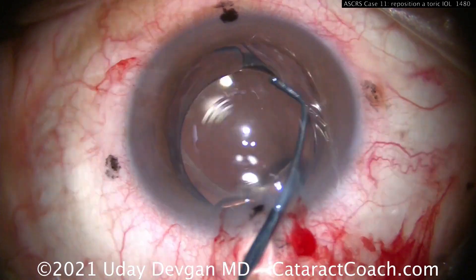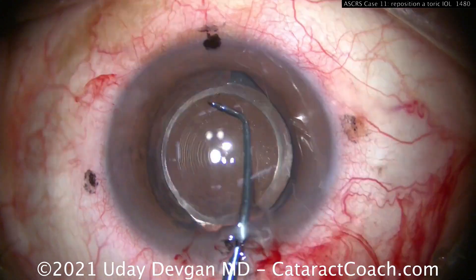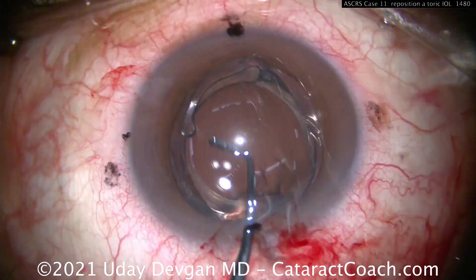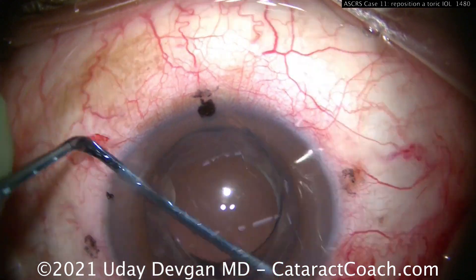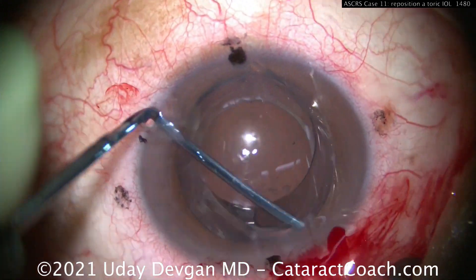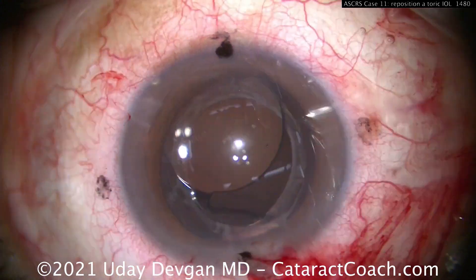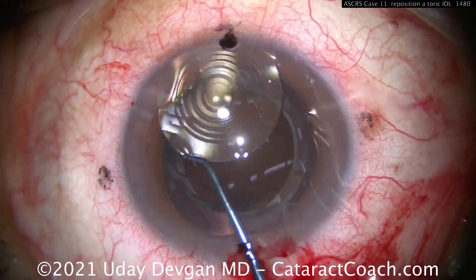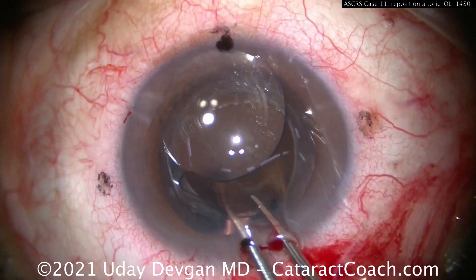There's visco-dissection going behind the optic — dispersive viscoelastic to help separate it. We'll try to break some adhesions using the spatula. One haptic comes up, but in this case there'll be a stuck haptic. Don't pull on it. Use the spatula again, break the adhesions, try again — not enough. Try one more time, break any adhesions and try again. Still not enough. Don't break the bag or the zonular attachments. Now you've freed it up, and you can get that lens up to exchange and take it outside the eye.